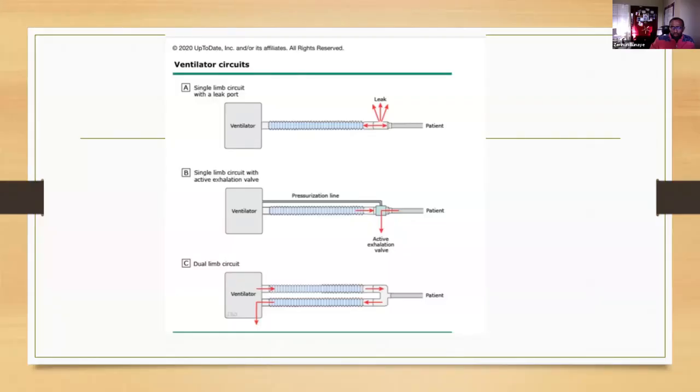One thing I would say is, I don't know what kind of ventilators there are in Ethiopia. You have to be careful. It has to have 2 limbs. With the one limb ventilator circuit, the exhalation port just exhales the air out into the room. I have seen reports of some areas where they are wrongly using that kind of ventilator. So it has to be dual limb, which means the exhaled air should always go back to the ventilator and be filtered.